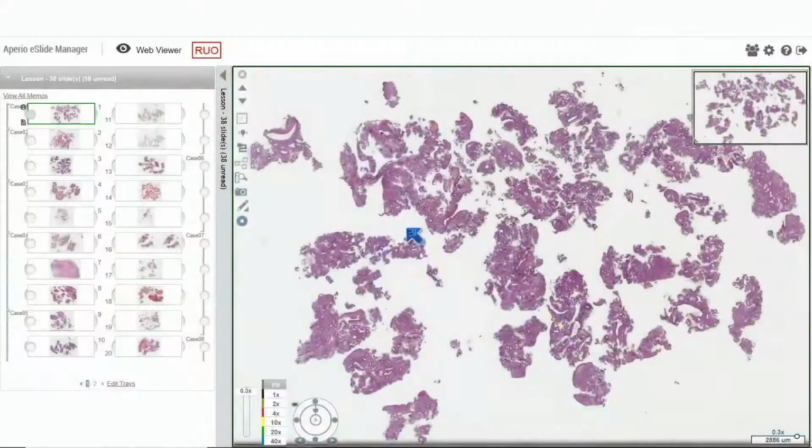All right, so then I'm going to take you through all the slides, and we'll spend a little bit of time talking about the pathology. All right, so the first case was that of a 35-year-old with irregular prolonged bleeding for 2 years.